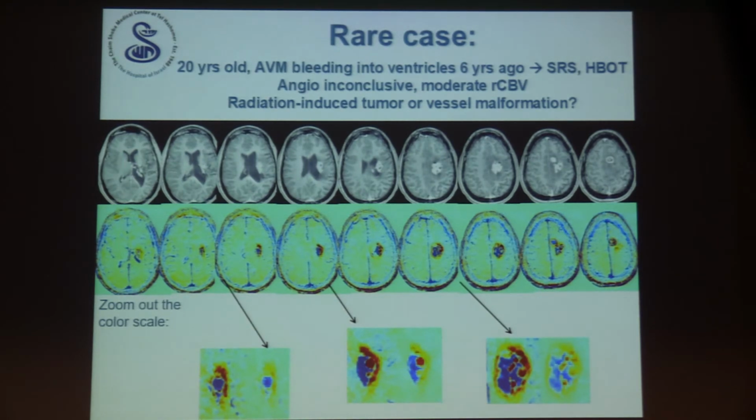It should be very rare, and we found those 5 or 6 cases throughout all the years, but one has to be aware of it. So our recommendation at the moment is to use some kind of susceptibility-weighted imaging in your protocol. Also, it may help, although in most cases it looks black and we think maybe it's hemorrhages, or it is hemorrhages. We don't always know. And of course, these patients always have the surgical screw near, or whatever, which is a problem with susceptibility-weighted imaging.